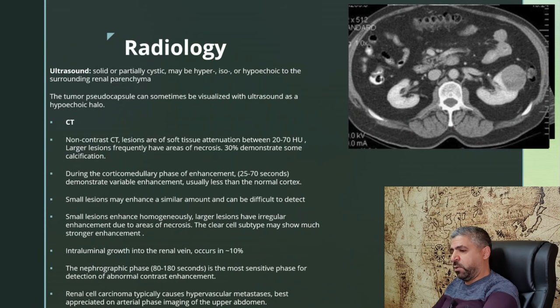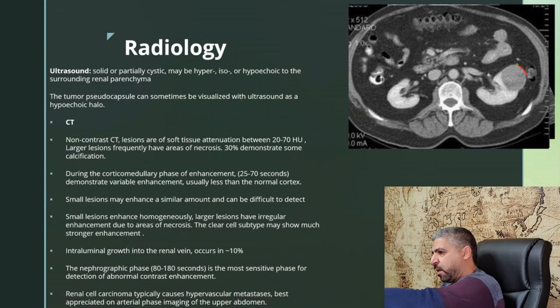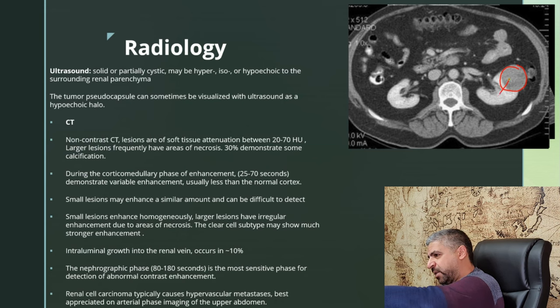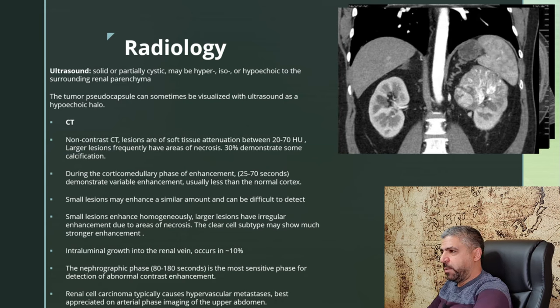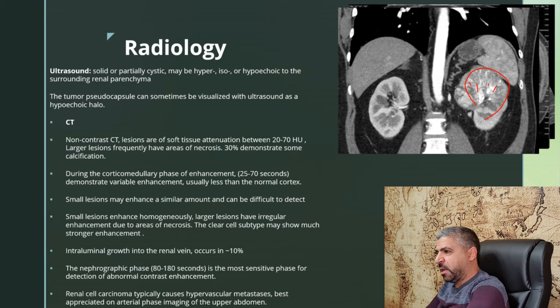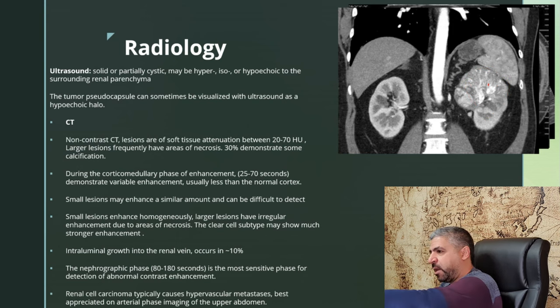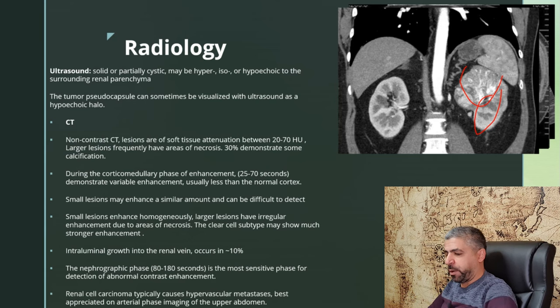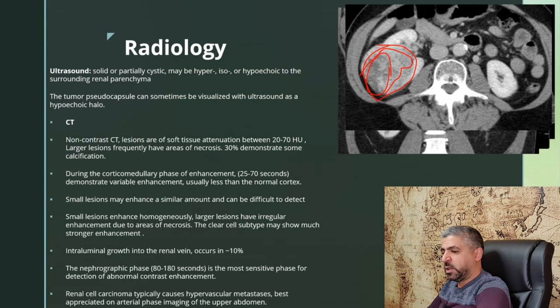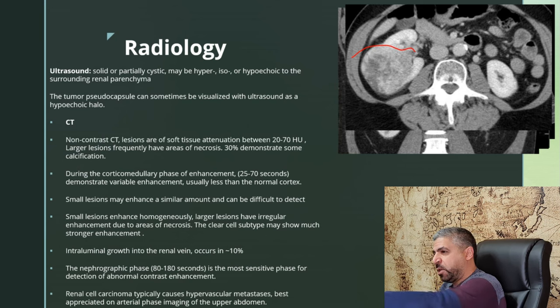Looking at these CT scan examples: in the corticomedullary phase, the lesion enhances but less than the adjacent renal parenchyma. In another example, the lesion shows areas of calcification and again enhances less than the surrounding parenchyma. In a larger case, the lesion shows vivid heterogeneous post-contrast enhancement with areas of necrosis due to the large size, with extension into the renal pelvis and collecting system.